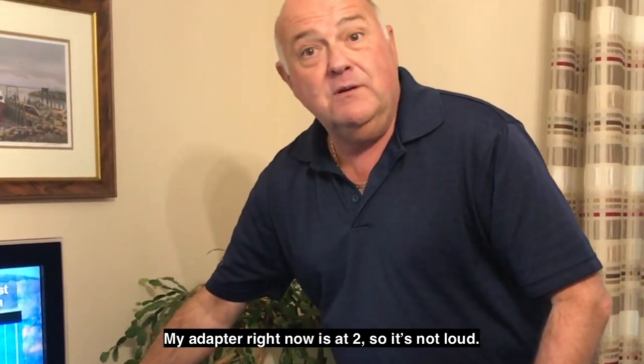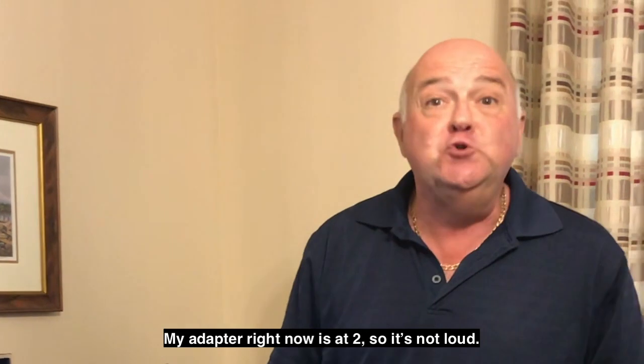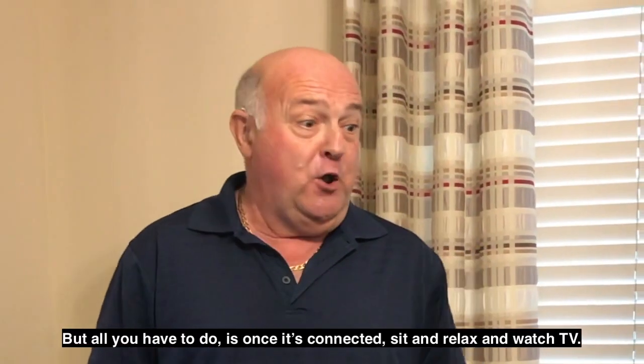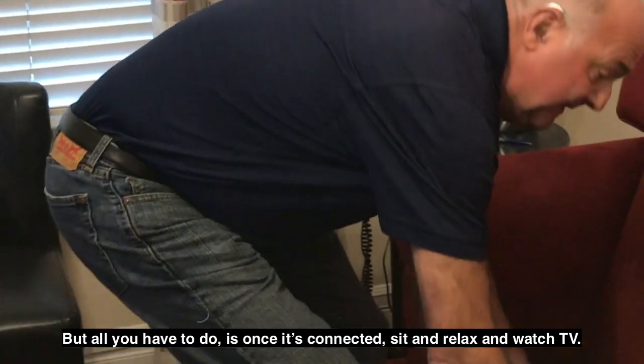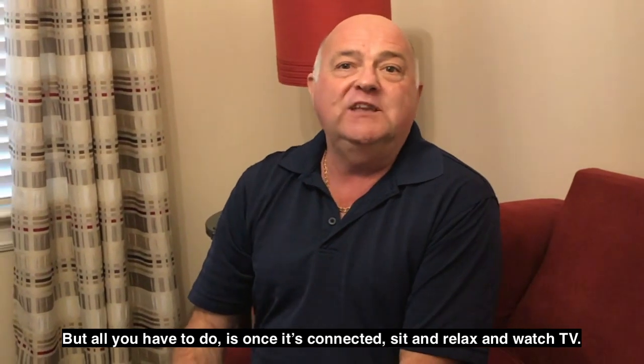My adapter right now is at two, so it's not loud. But all you have to do is once it's connected, sit and relax and watch TV.